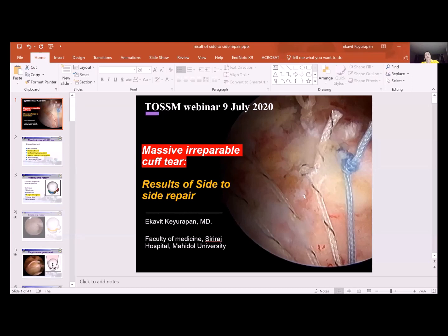Before, I tended to do a biceps tenotomy, but right now, instead of tenotomy at the glenoid, I just do tenotomy at the bicipital groove, mobilize it and use it as a graft. So sometimes when I start my rerouting technique, I cut the biceps after rerouting, but I think keeping the continuity without cutting is more stable. So that's the reason why I didn't cut.